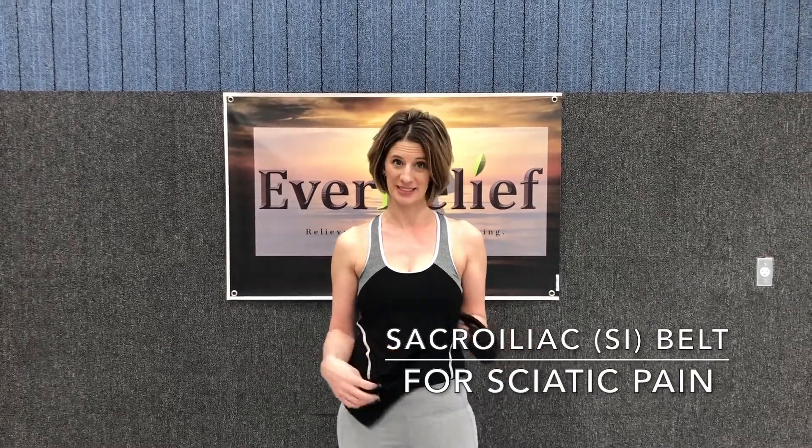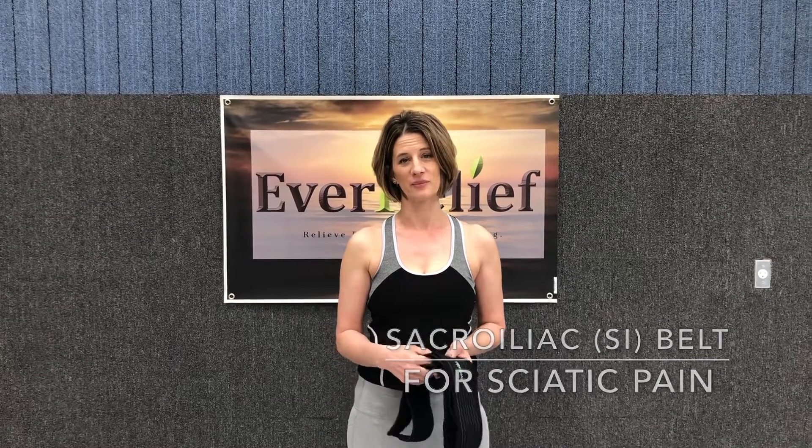Hi from Ever Relief. I'm excited today to show you our SI belt — it's a sacroiliac belt. As founder of Ever Relief, I'm always looking to bring products to our customers that support their pain relief journey. Nine years ago, I had back trouble due to a pregnancy, and I had a bulged disc and I've had a lot of low back pain and sciatica issues. So a belt like this was really exciting for me.